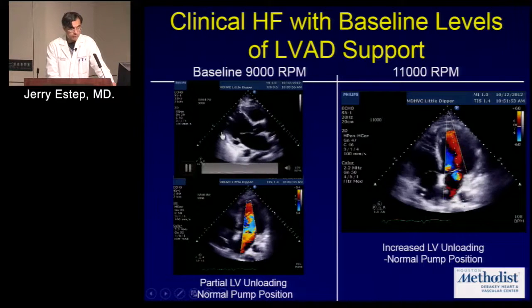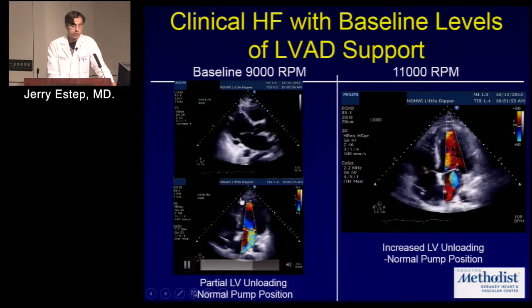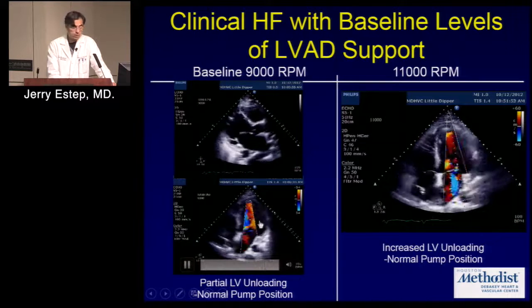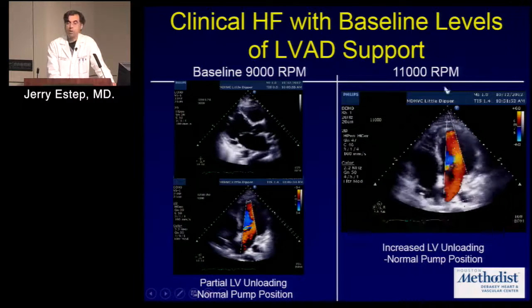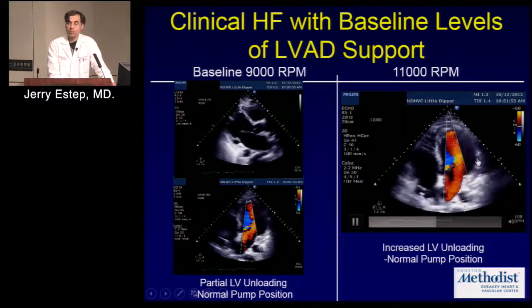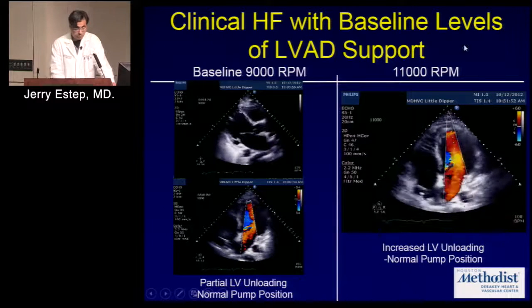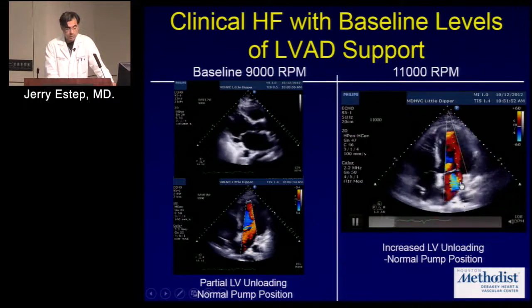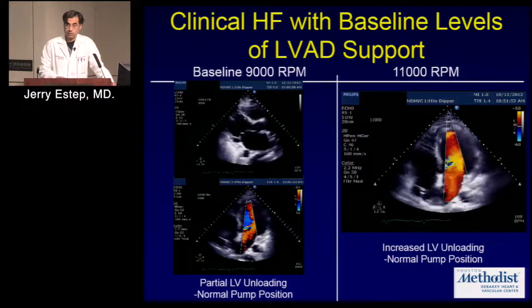This patient had a perfectly positioned inflow cannula, significant MR. So we always try to control afterload, treat with blood pressure, treat medically with diuretics. But it was really with pump speed augmentation, having to run him much higher than what is typical. For the HeartMate 2, typical is 9,400, 9,600 revolutions per minute. And so echo can help us tailor that pump speed based upon the substrate we think is causing or contributing to the persistent breathlessness. And in this particular case, it was partial unloading, manifested by persistent significant mitral regurgitation.